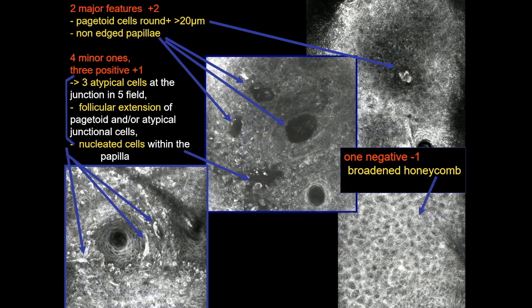And this is amazing work. They've imaged so many patients to come up with such an algorithmic scoring system for lentigo maligna, which is difficult to diagnose clinically. It's difficult to diagnose histologically, but it seems that confocal has a more readily accessible view of the skin without cutting.